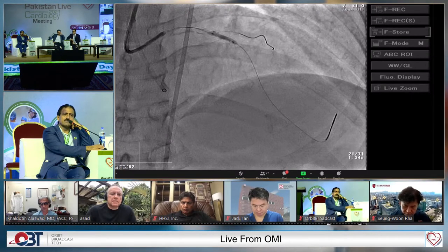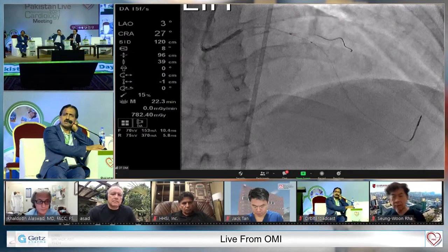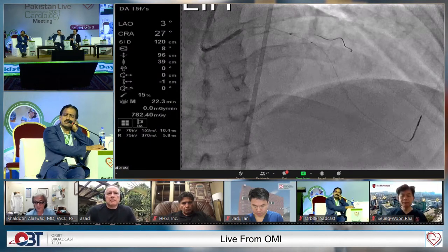Sohail, can you hear us? Yes, I can. So tell us what did you do, and also once you have crossed and you're sure that the wire is distal, do you still need the right guide or catheter over there?